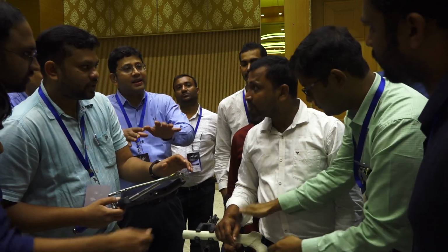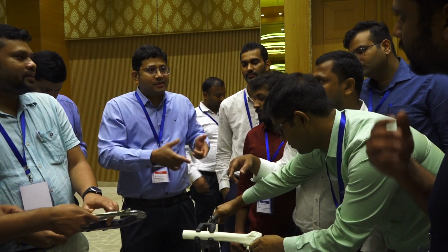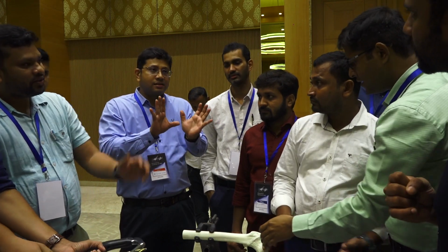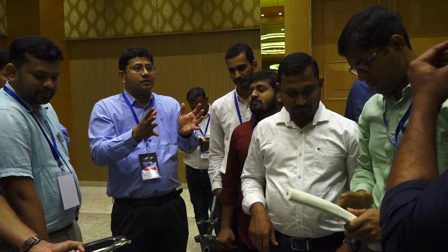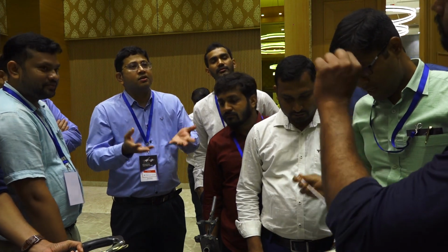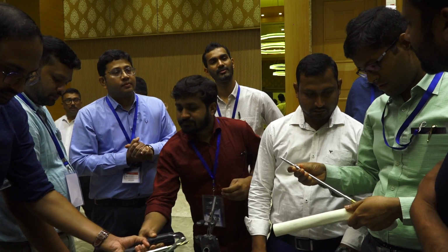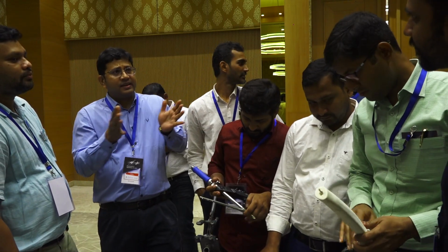After that, the nail is just a device to hold it. Additional stability is given by all these encircling wires or plates. So these are just implants to give more stability, to buy you more time till the bone unites. If there is bone loss, a very osteoporotic bone, bone will be lost. Bone will be there only. It's not a compound fracture. Completely shattered bone, where we are not able to. There is a grey zone.